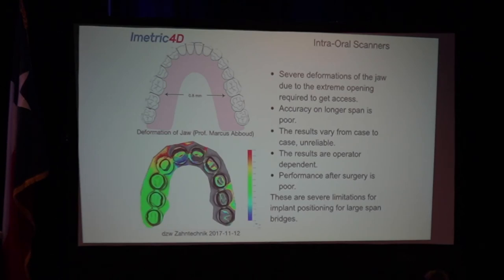Because scanning, you're going to get the most inaccuracies from going from the occlusal to the incisal edge in the front. And if you have an iTero, they're going to show you that once you go in the occlusal and then you go back around, you're going to do a rollover in the front because you go from a big, wide occlusal table to this small incisal edge that's real thin. What assistants want to do, and I'm going on a tangent because this is going to save a lot of people from having missed crowns that aren't fitting, is they go from this wide occlusal table, and then they go to the palate and only get the backside of the tooth. And then they go around the buccal, and they capture this side. So you have the whole incisal edge that the scanner is having to guess. So that's a bad scan strategy.